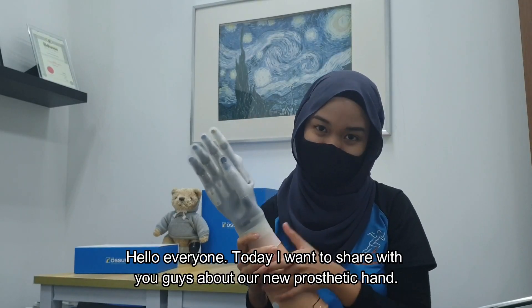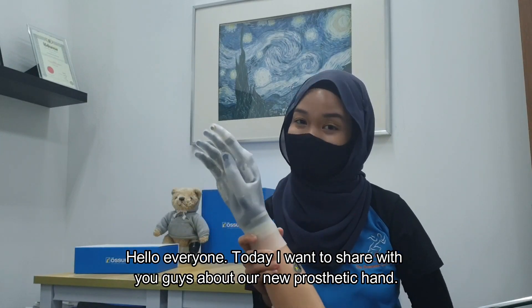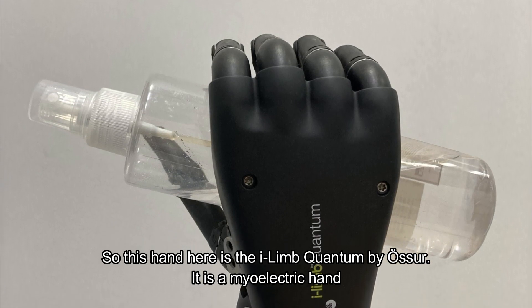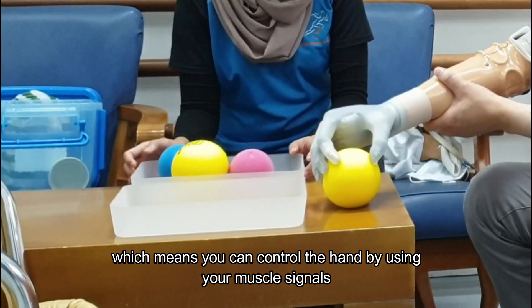Hello everyone! Today I want to share with you guys about our new prosthetic hand. So this hand here is the i-Limb Quantum by Össur. It is a myoelectric hand, which means you can control the hand by using your muscle signals.